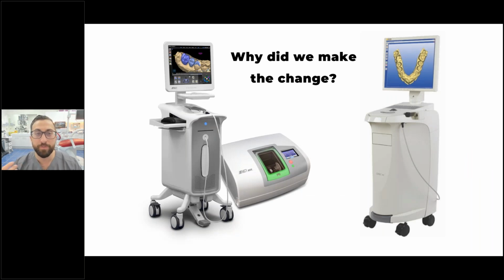When my father was first getting into digital dentistry, these were the two options. It was E4D, a scanner that was very rudimentary compared to what we have now, and now E4D is basically Planmeca. And we also had CEREC Blue Cam or Red Cam back in those days. Now, the interesting thing is that these were very hard devices to use compared to what we have now.